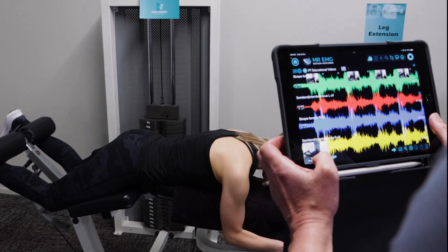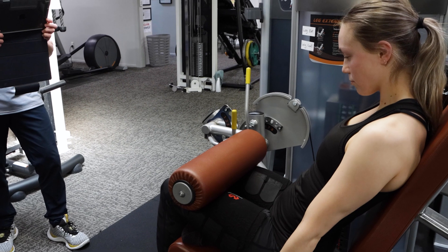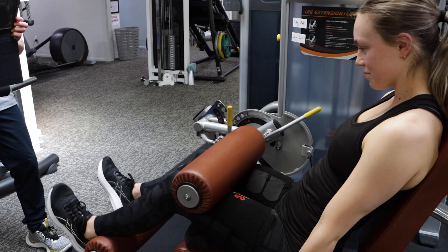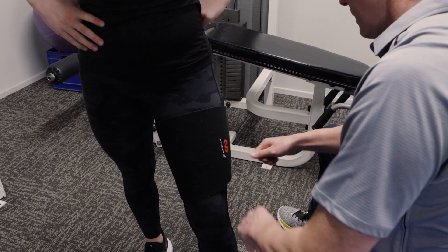Next we will test 52 kilo seated leg curls. Ensure your client does not wear loose shorts that can pull on the sensors and cause signal artifacts. Use leg tape for the hamstrings if necessary to anchor the sensors to the skin.